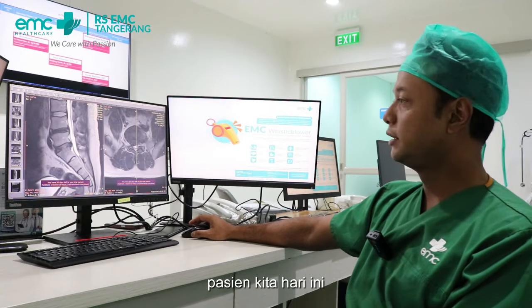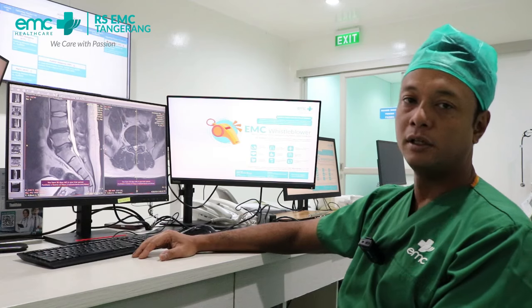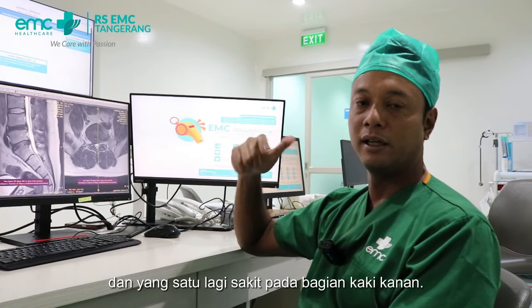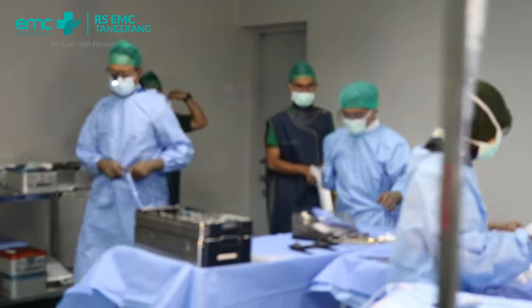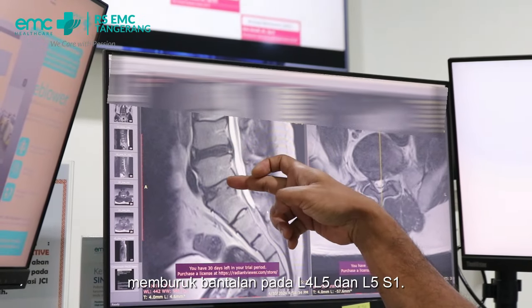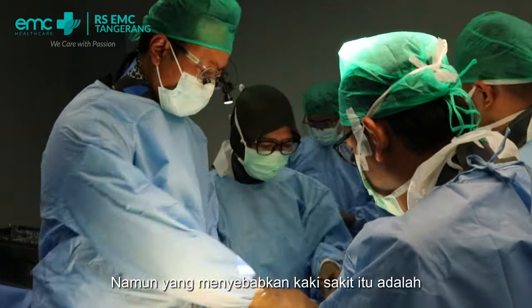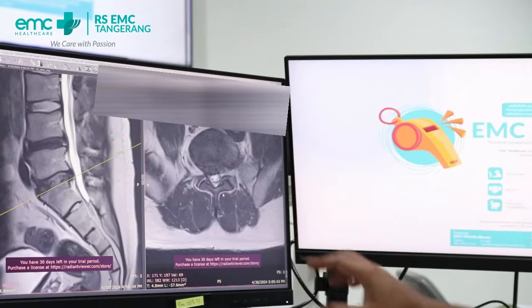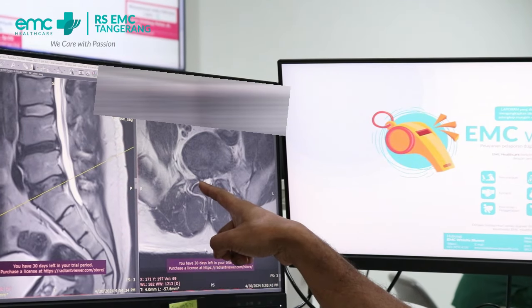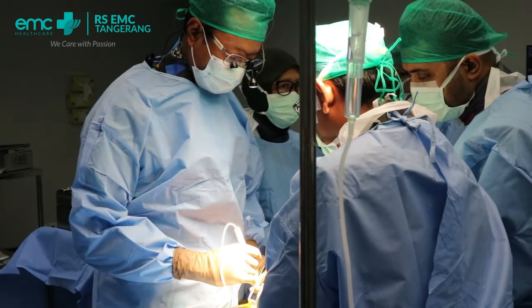This is our patient for today — a young male, 34 years old. The main symptoms are lower back pain and right leg pain. For the low back pain, you can see on the MRI he suffers from degeneration at L4-L5 and L5-S1, which may cause the back pain. What caused the leg pain is a nerve impingement due to the herniated nucleus pulposus, where the right traversing nerve root is compressed.